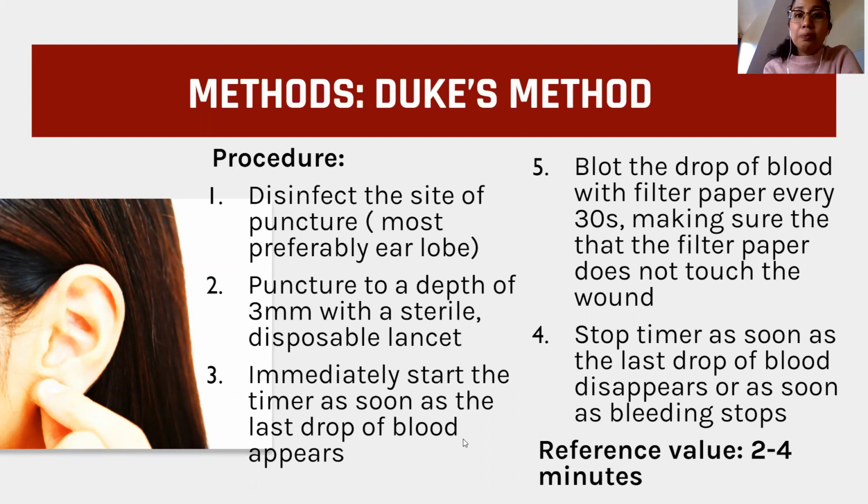So dapat, as much as possible, the bleeding will only last within 4 minutes. Beyond that, class, it could be an indication that there's something wrong with vasoconstriction or platelet plug formation.